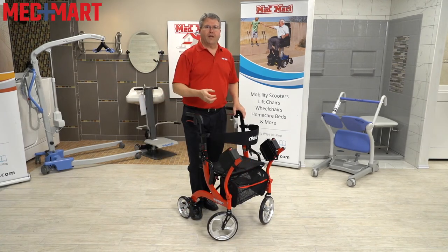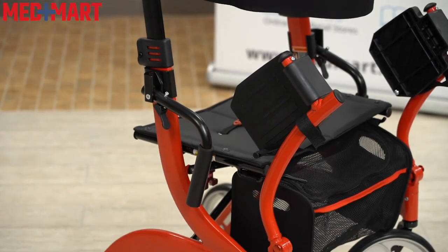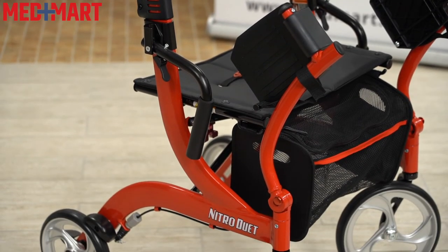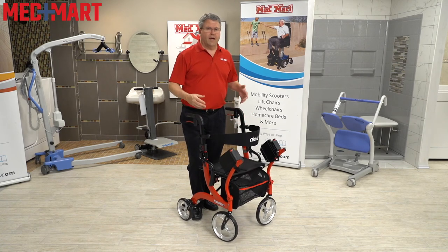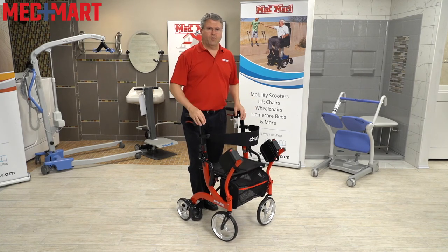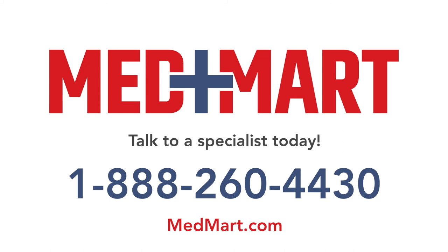There are only a few combination walker transport chairs on the market, but this one hits a lot of boxes as far as convenience. It's super easy to use as a walker by itself, and just when you need it, it has that transport chair capability. If you have more questions about this or any of our other products here at MedMartOnline.com, give us a call at 1-888-260-4430.